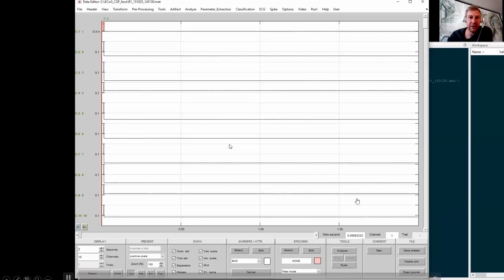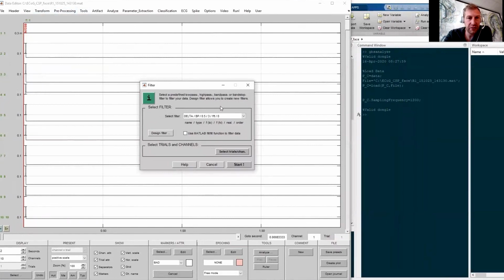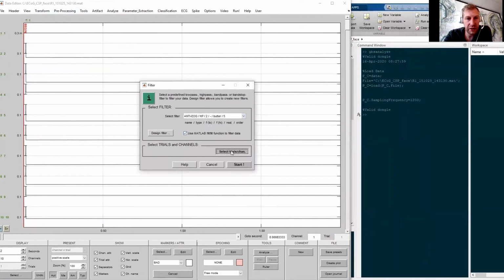Now, if this is a meaningful activation and a task-related biomarker that we want to utilize, for example for a brain-computer interface, we can calibrate a classifier based on this data that we have already stored.